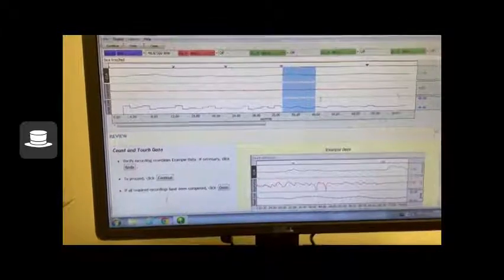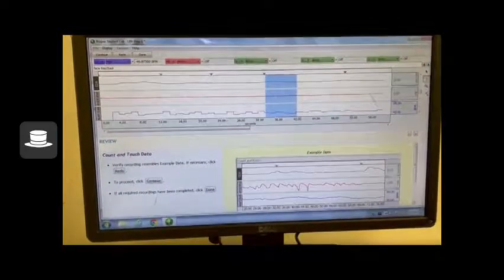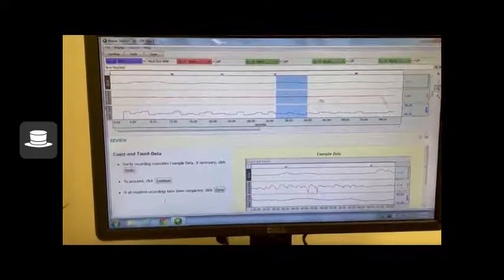If you need to zoom in on a section to get a more specific value, use the magnifying glass on the sidebar to accomplish this.